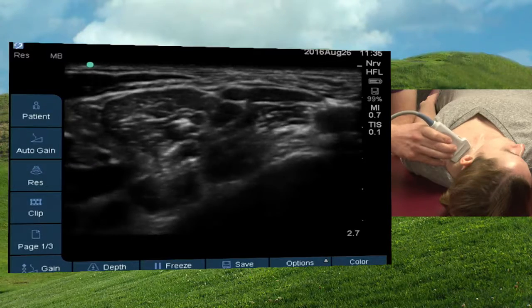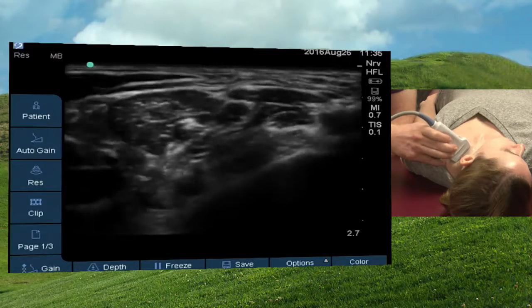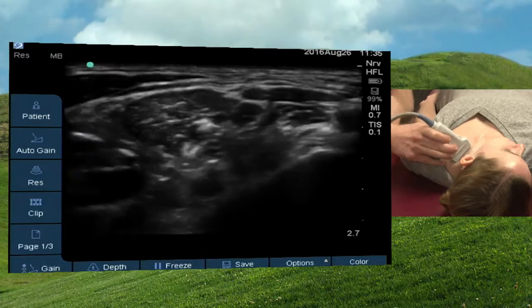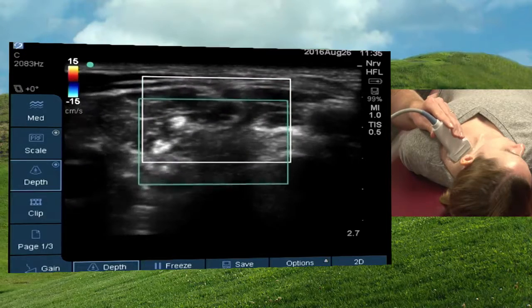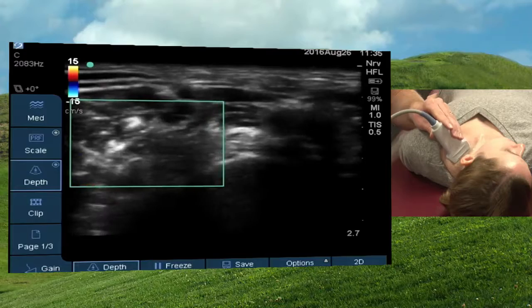And so in order to do this block, we would enter from the right side of the screen. We would watch our needle go in. You want to maybe put the... I was hoping for a pointer, but we don't have one. So I guess I could freeze it. Nothing matters. Yeah, it doesn't help.